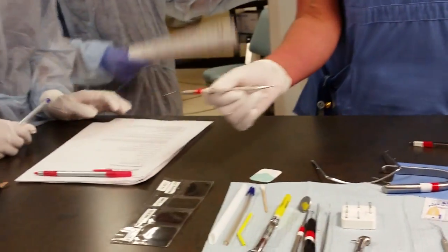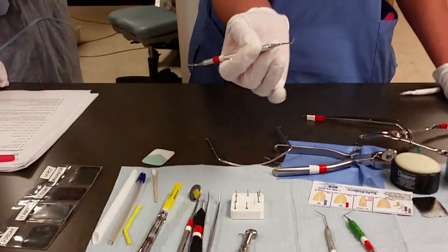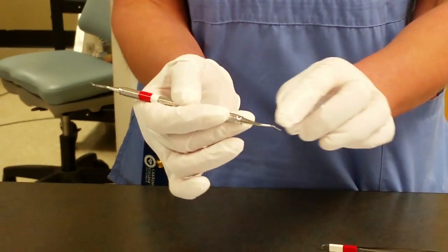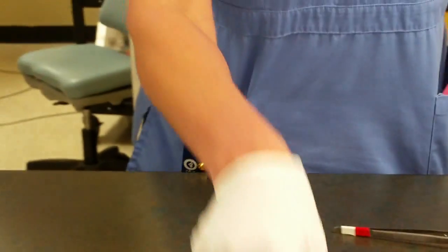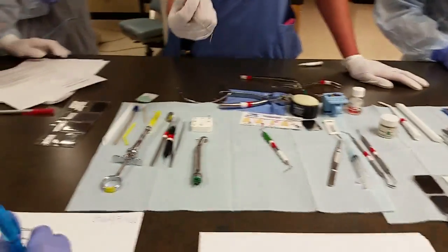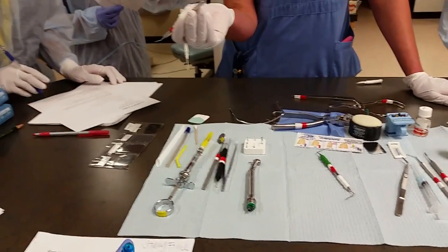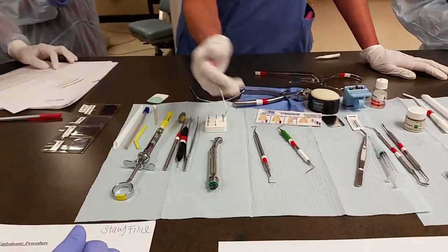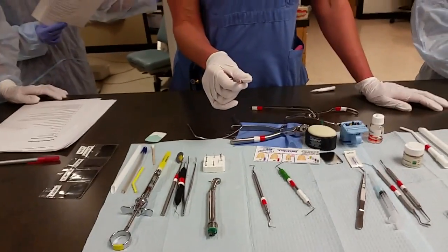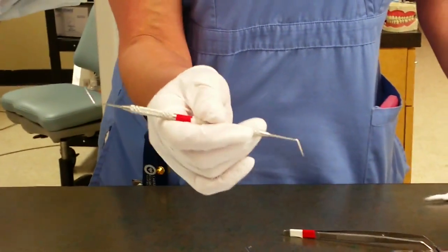This is considered a curette or an endodontic spoon. See how it's long enough to go in there and scoop anything out? It's not a spoon excavator — it's an endodontic spoon. They look the same but the endodontic spoon is just longer, so they have a different name. This is an endodontic explorer, used to explore the canals and find out where the canals are inside the tooth. As you can tell, it's kind of pointed.